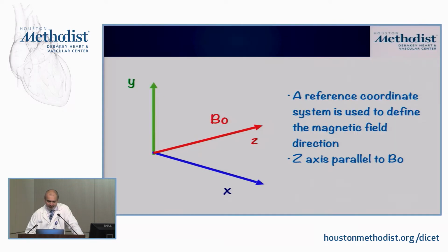Now, the other important thing is that within the scanner itself, we also create a reference coordinate system.